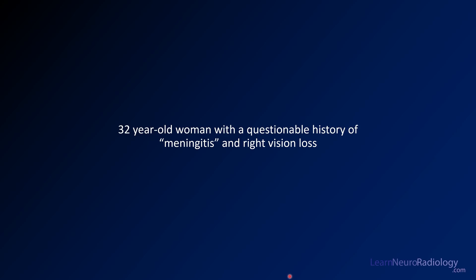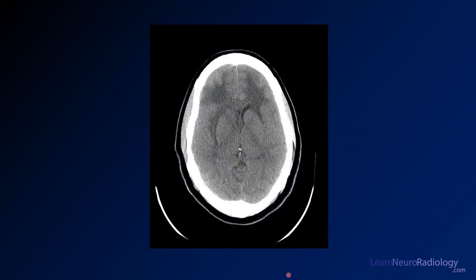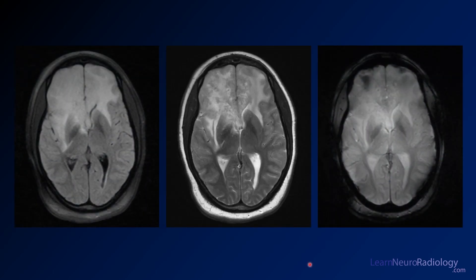The second case is a 32-year-old woman with a questionable history of meningitis at an outside hospital, now presenting with right-sided vision loss. The CT above the orbits is clearly not normal — there's edema in the white matter of the frontal lobes and probably the genu of the corpus callosum. On MR through that same region, it's markedly abnormal.